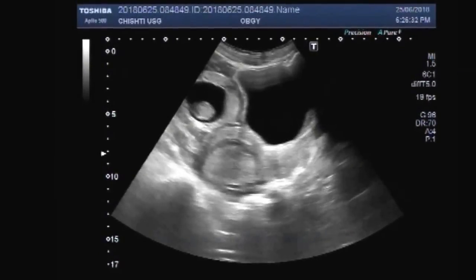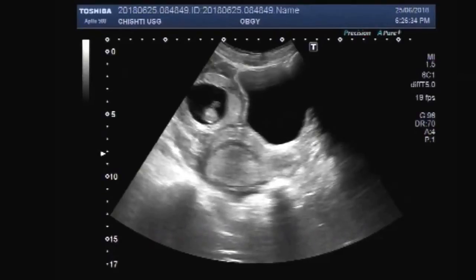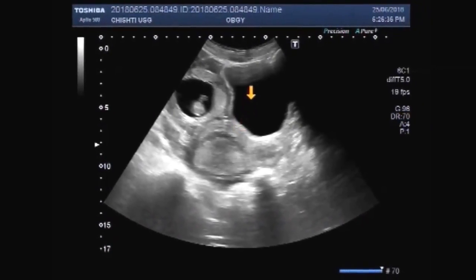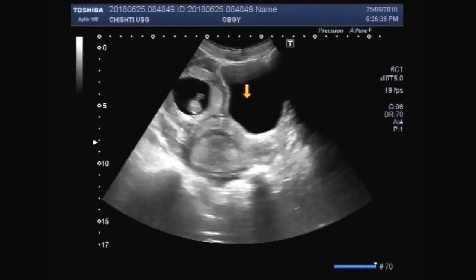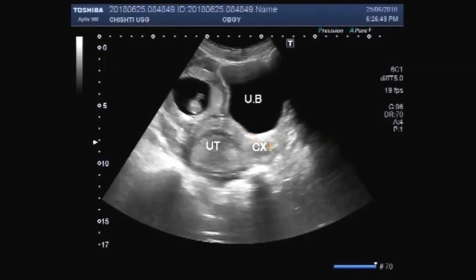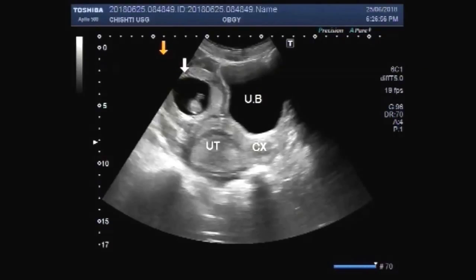You can see the urinary bladder, uterus, and left ovary having a small fetus. This is the urinary bladder, this is the uterus, cervix, and this is the left ovary in pregnancy.